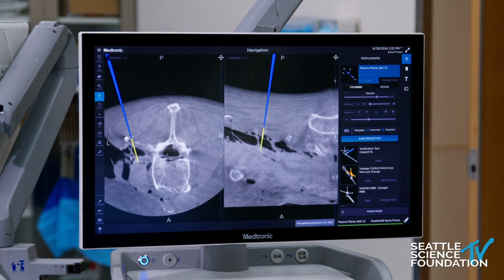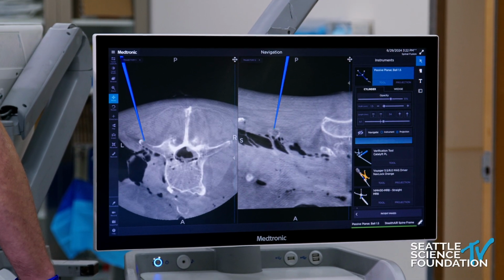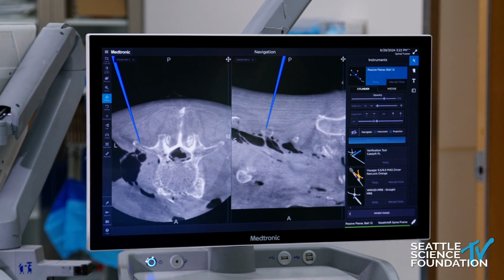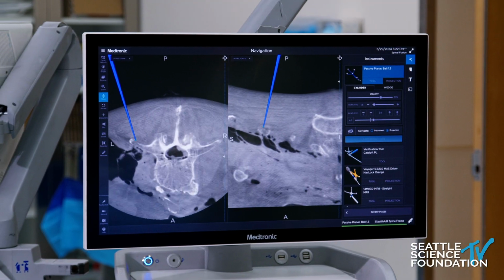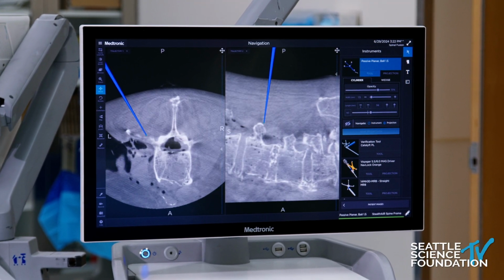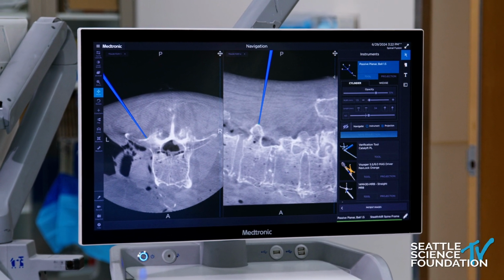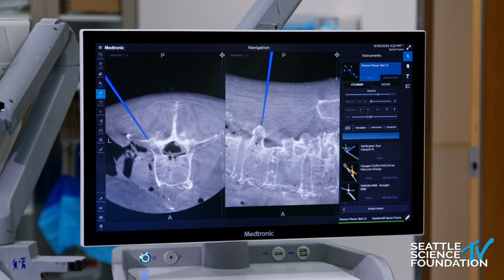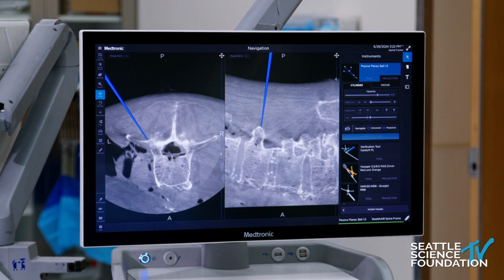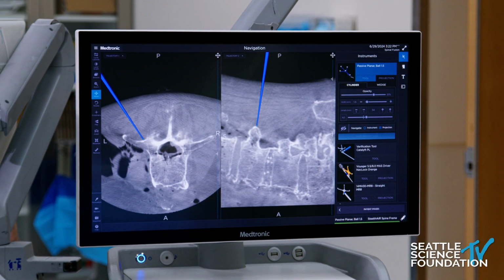Yeah, so the tip of the instrument is blue, and you can see here how I'm really straight on the T-piece, right? I go up and down on the sagittal views, and it looks perfectly accurate. So this is very, very accurate. In my opinion, that's the best way to really confirm accuracy.